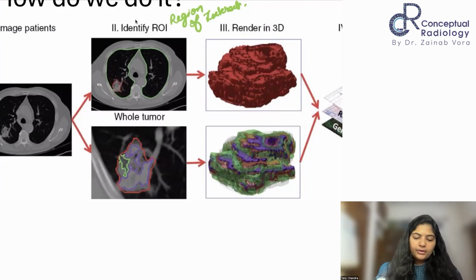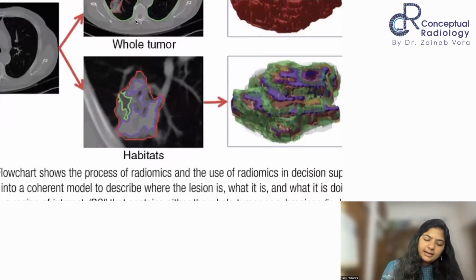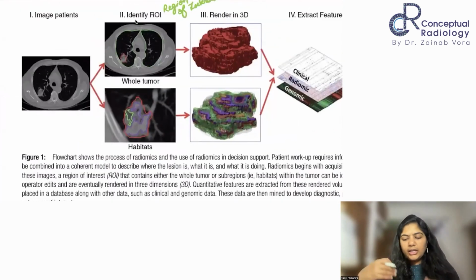Okay. So we can see it in respect to the entire organ, or we can further micro dissect it, like we find different areas here. So we are again marking these areas, right? And then you can render it in 3D to give you a better idea, right?